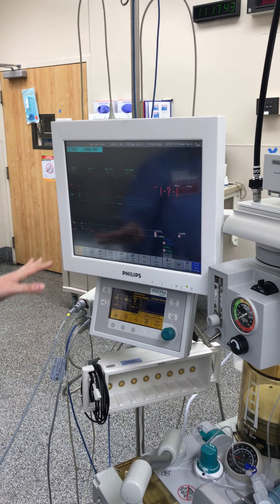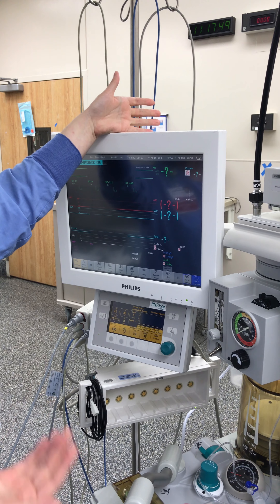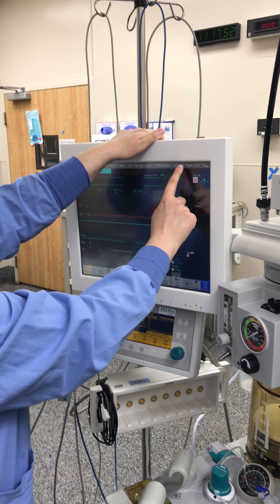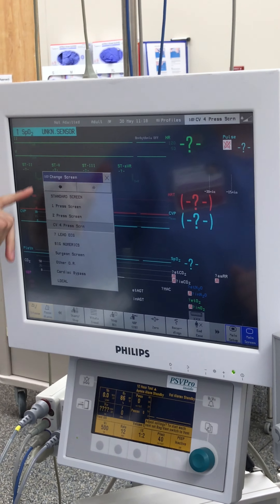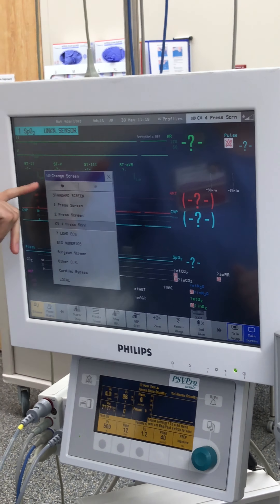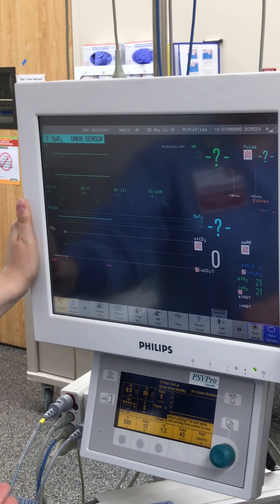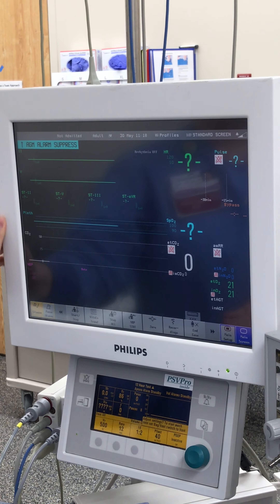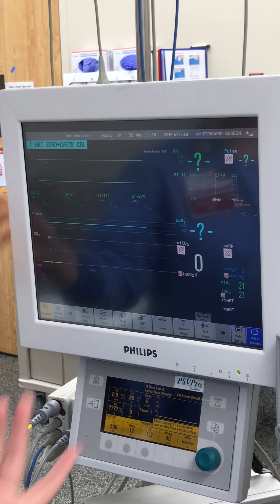This monitor automatically went to a pressure screen. If your monitor did not, come up here to the corner — this is touch screen as well. Hit that, and you can choose standard screen, one pressure screen, two pressure screen, or CV screen like we use in the heart room. If it came up with a standard screen, you don't have any arterial or CVP information on there, so you would just come up here and hit pressure screen. Now it comes up with our art line and our CVP.